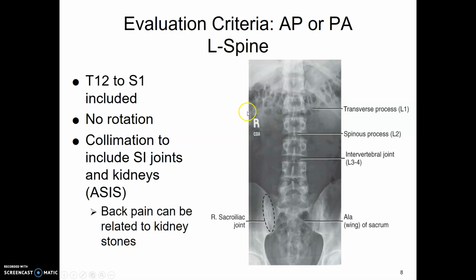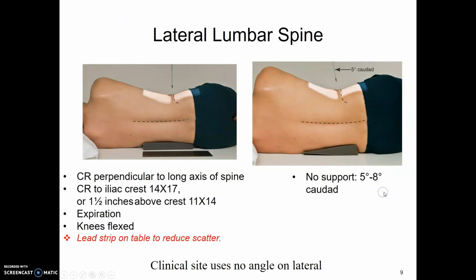Please don't put your marker where this person put their marker, because a lot of back pain can be related to kidneys, and guess where this marker is? Essentially right on that patient's kidney. So please don't put it there. I'll show you where to put it.